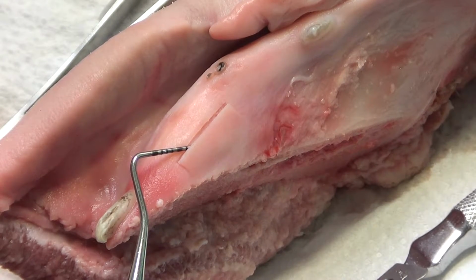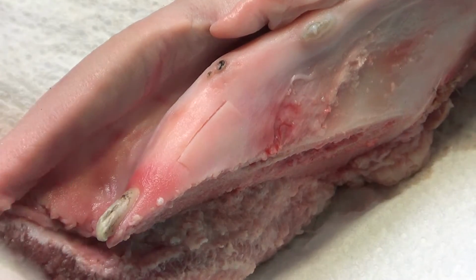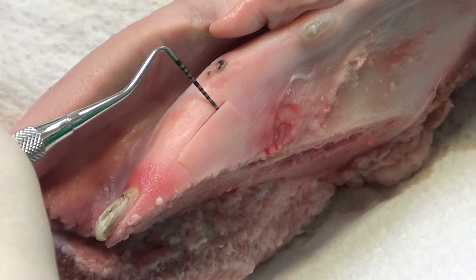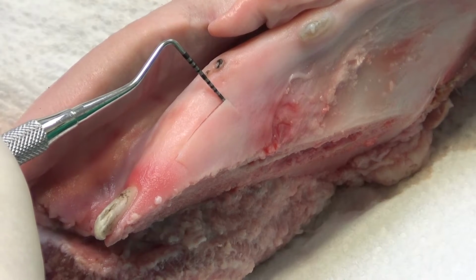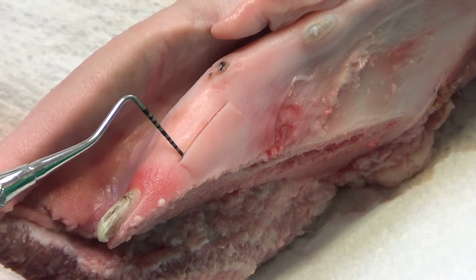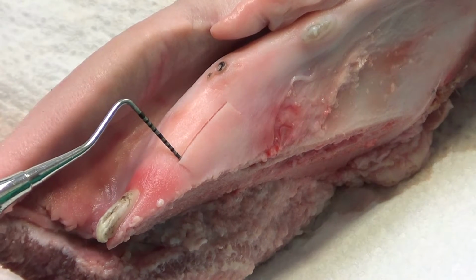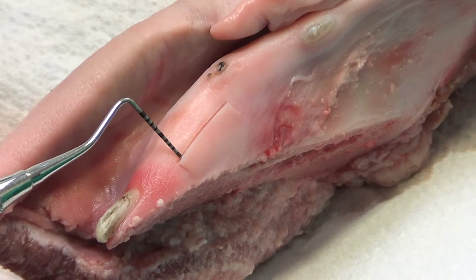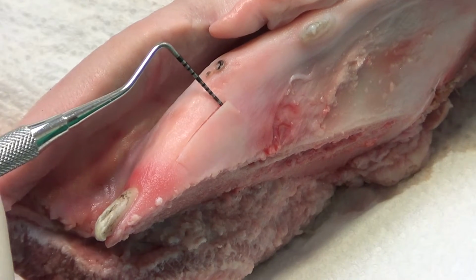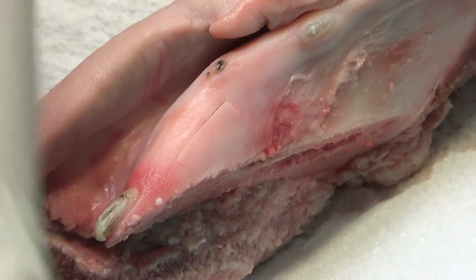So at the end, this is 4 mm deep with all the length. Okay, you can see it with the probe, you can try, and this is 4 mm deep in terms of horizontal direction.